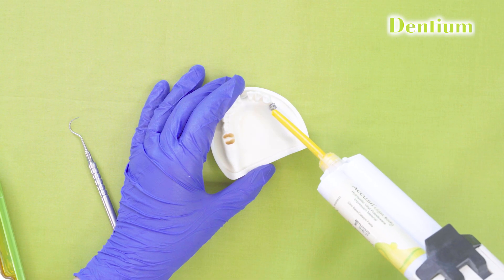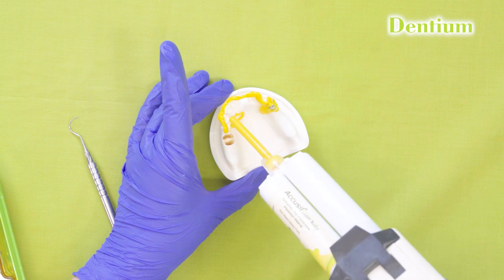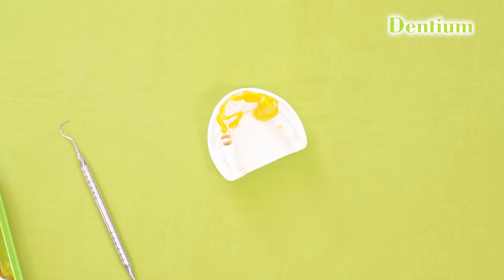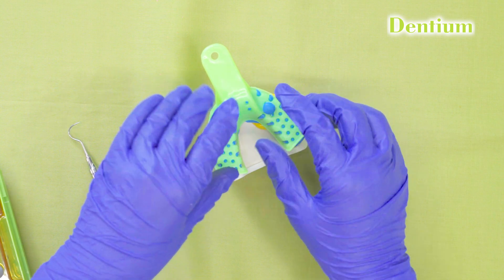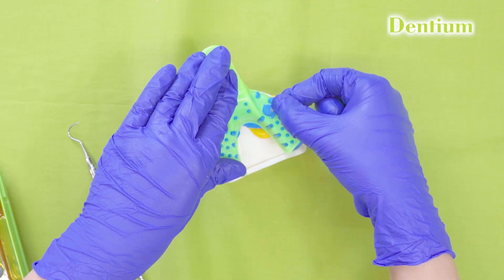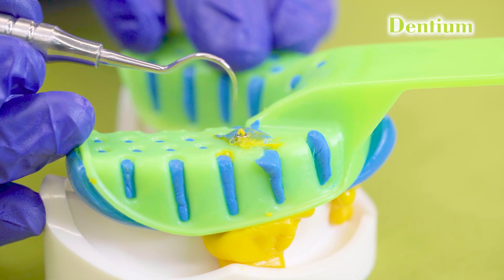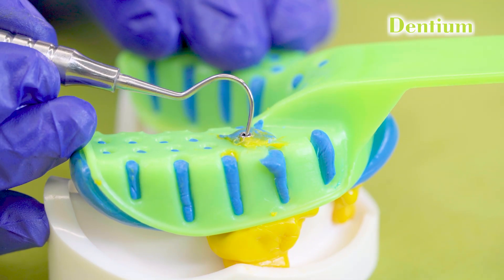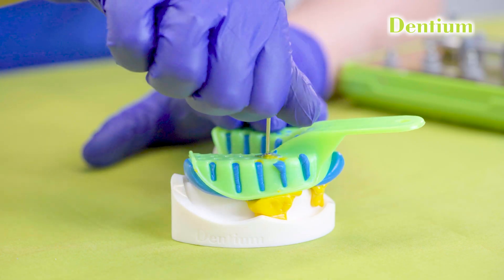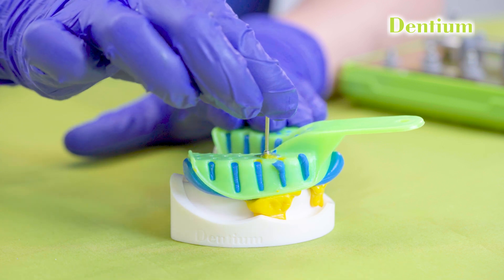First, I will start putting the light body around the impression coping. Now we will load the heavy body into the impression tray. We will then seat the impression tray over the model, making sure the screw hole is nicely visible, and apply uniform pressure over the tray. Once the material is set, check if there is any set material inside the screw hole and remove it with a probe or explorer. Then insert the hex driver inside the screw, unscrew it very gently, and remove the impression.